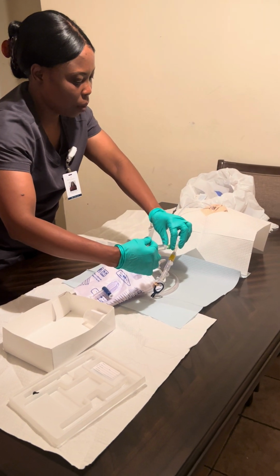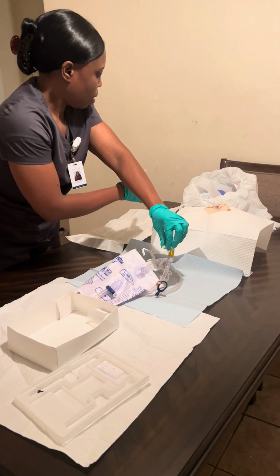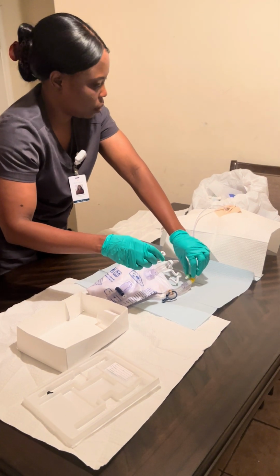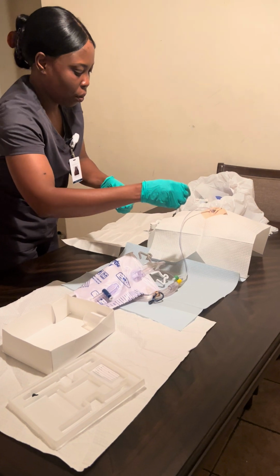Okay, Mrs. Smith, now I'm gonna remove the tube. I'm gonna put it in the trash. Okay, Mrs. Smith, now I'm gonna clean you up.